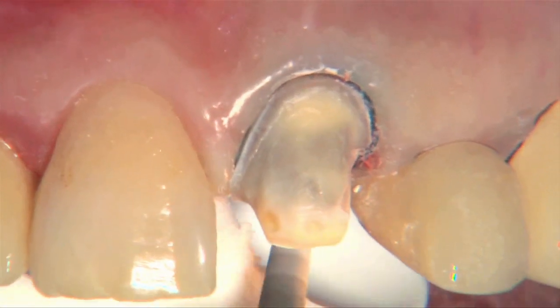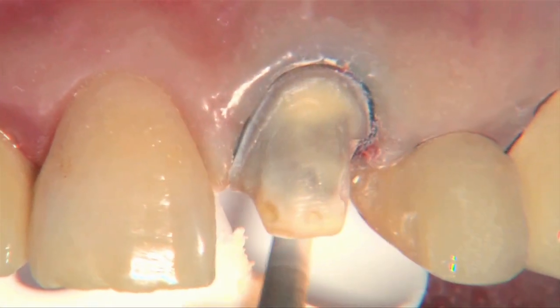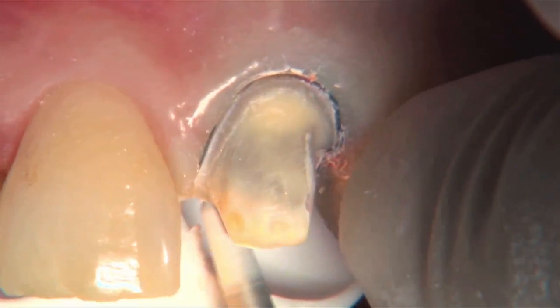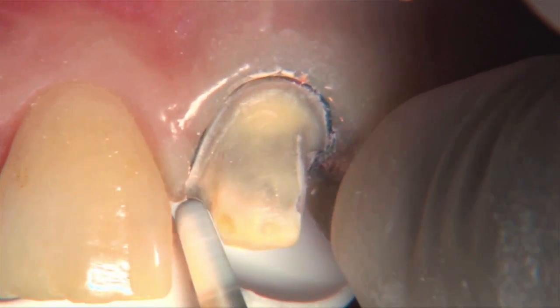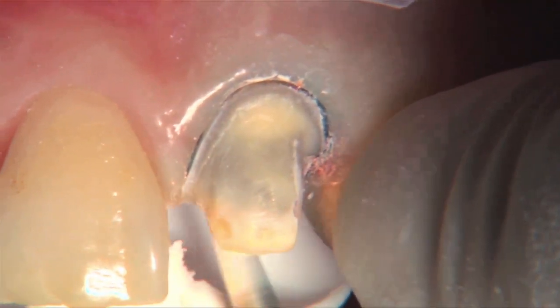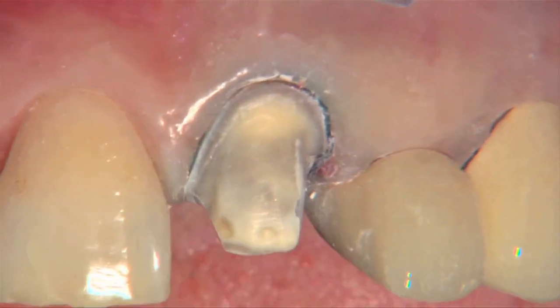But this is that 856025 fine grit burr being used here to smooth out any of the chips in the margin from the super coarse burr. And so again, only on an endo tooth would I drop down the margin a little bit more at this last step, just because I don't want to see the junction between the prep and the crown itself, because I know the prep's going to be much darker.